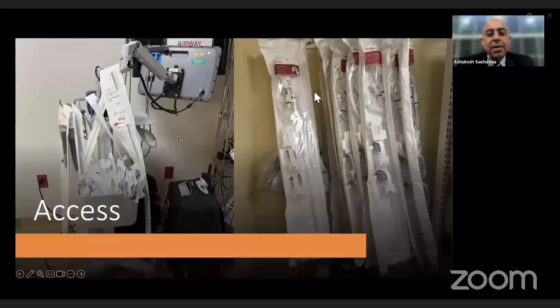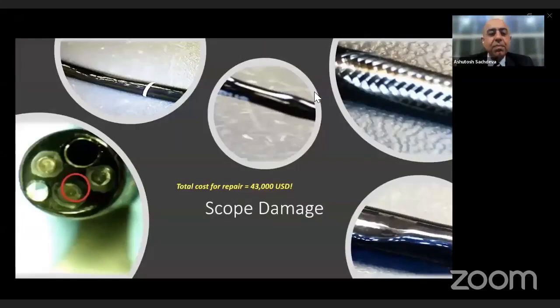At our center, on the left, there's an emergency airway cart. You can see there's a monitor and a stand with a GlideScope, which provides a blade that has an anterior angle. And then we have flexible single-use bronchoscopes along with exchange catheters ready to go with an airway bag. In our bronch suite, we have another single-use scope, in particular because of its rotational component and high definition video capabilities that we use in our procedural suite.